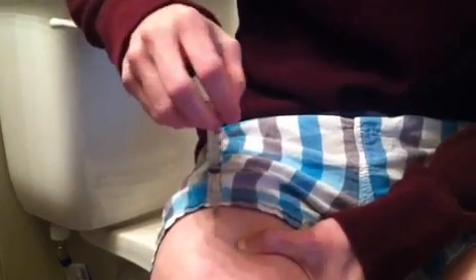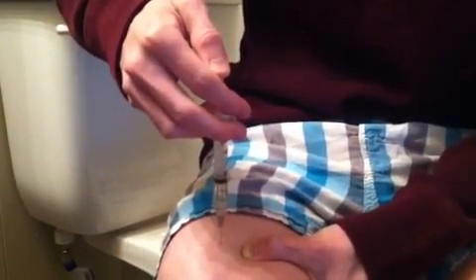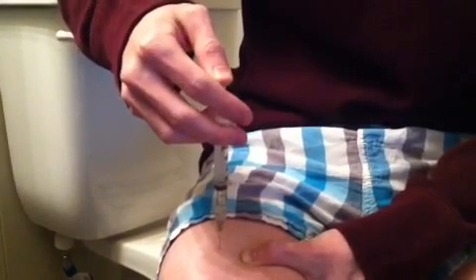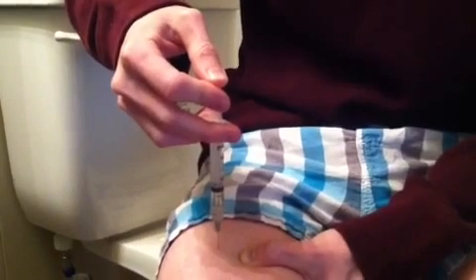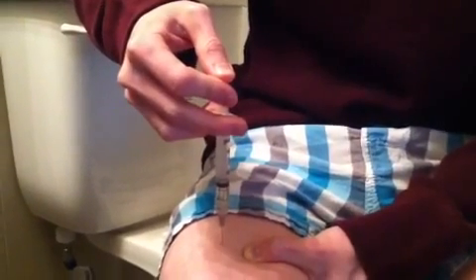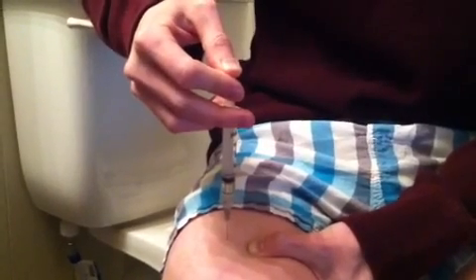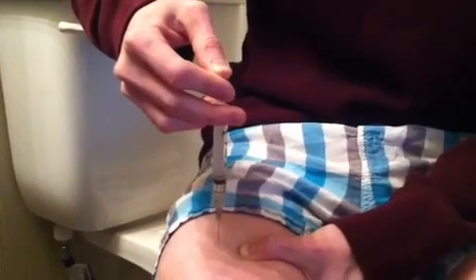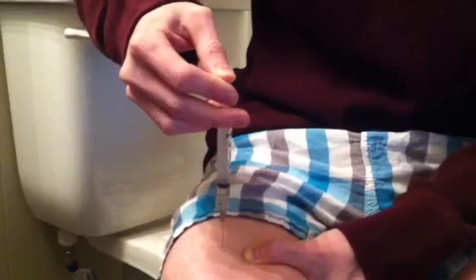Okay, and then you're going to start injecting. One thing I found is that you don't want to inject too fast because you start to feel a burn. You always want to make sure your needle is upright. You don't want to bend your needle while it's in your leg. It's not very comfortable at all. And the first time I did this, I was very nervous. It did not feel good at all.